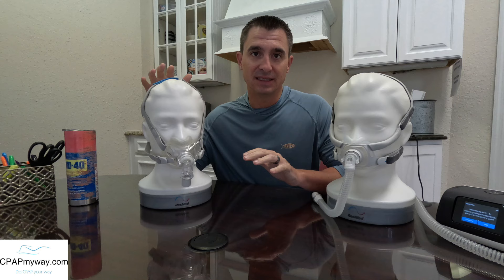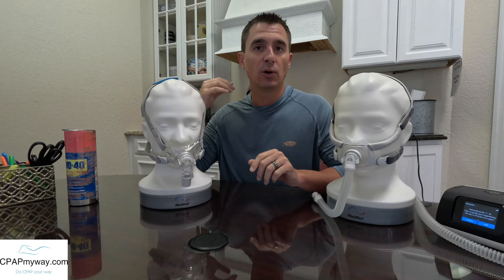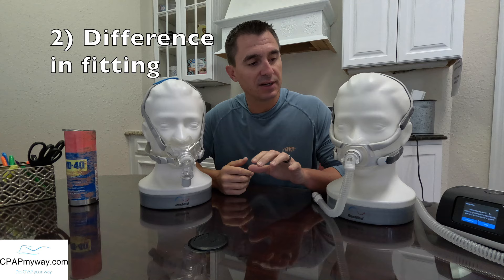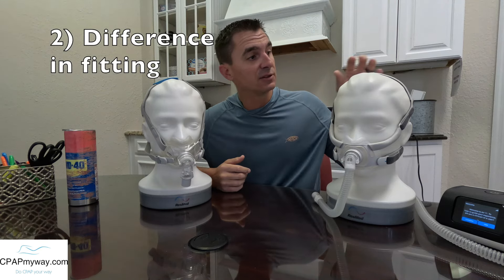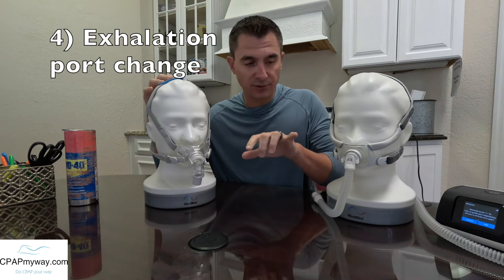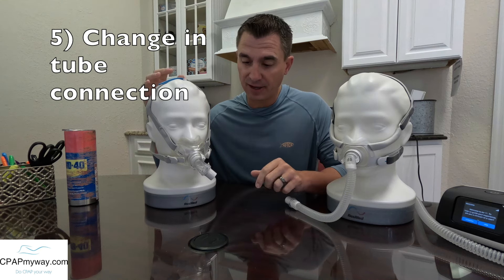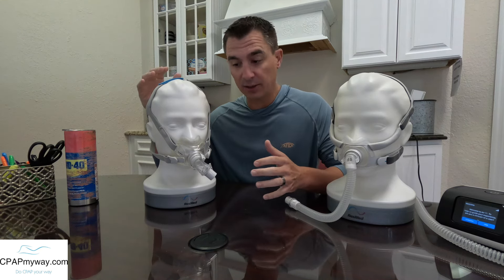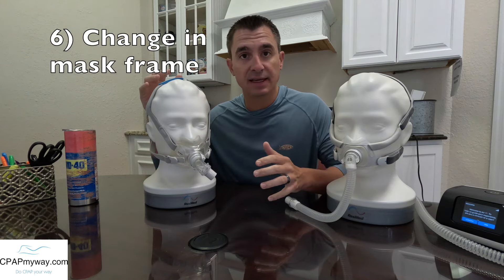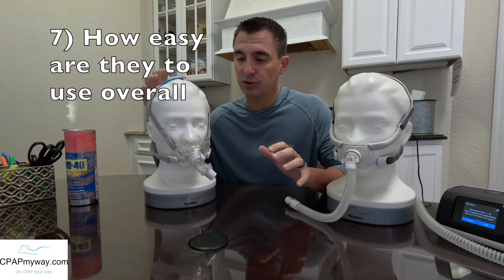It's not going to be a detailed video of either one, so we're just going to be going over the highlights of each. I'm going to go over a few key points — the difference in the seals, the difference in how they fit, the differences in the headgears between the two, how the exhalation will differ, how the different tube connections line up and how that will affect not only how the tube connects but how you may move around in bed, the differences in the mask frame, and then the overall ease of use on the two different models.